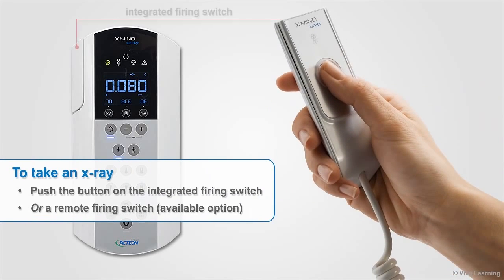To take an X-ray, simply push the button on the integrated firing switch. If you prefer, a remote firing switch is also available.